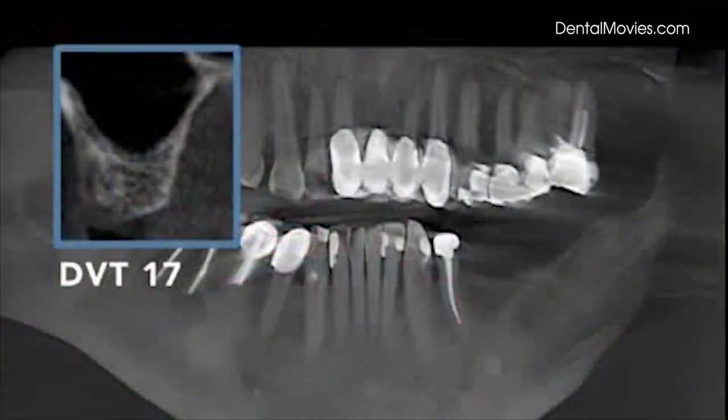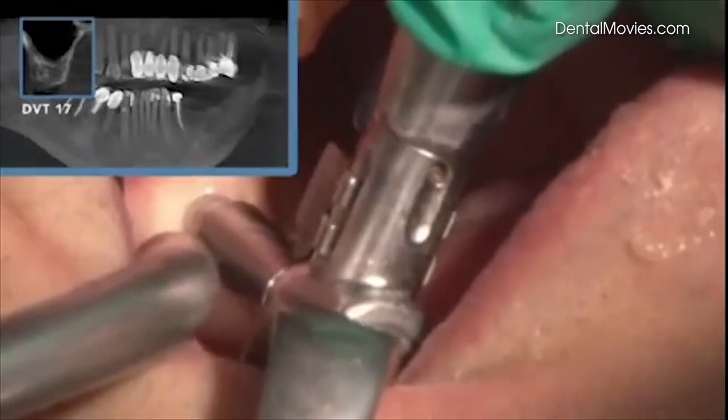The sinus lift is done at position 1-7. This will be a bridge 5, 6, 7, with a remaining bone height of 6 mm.